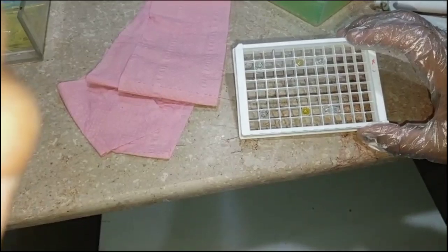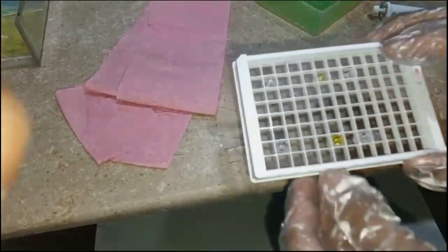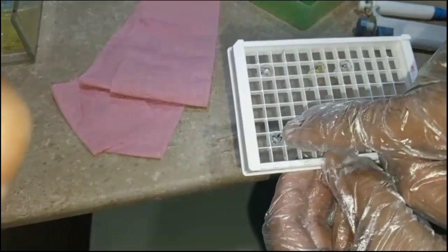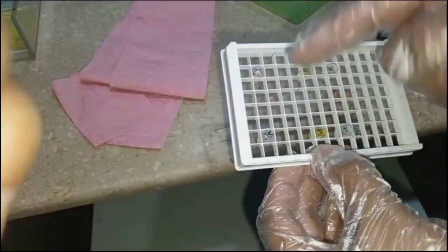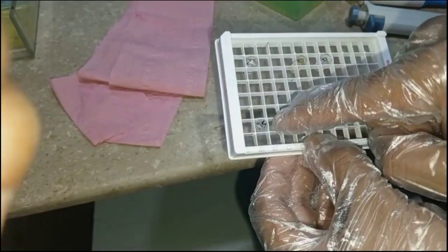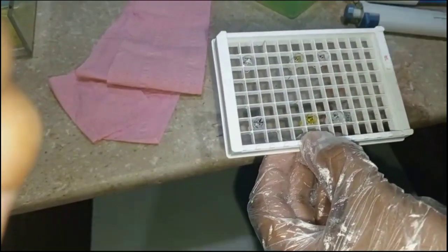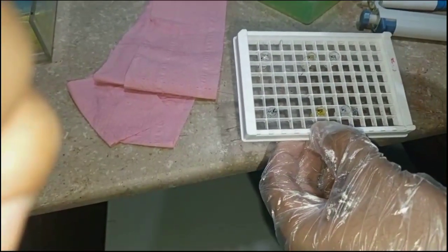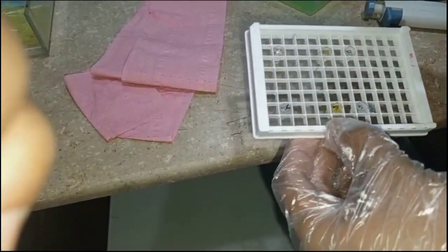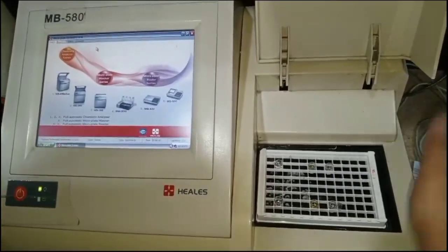As you can see, the second well of Ag and Ab is the yellow color. In case of the Ab it is also yellow color, but in case of the Ag it is positive, and in case of the Ab it is negative. Okay, the yellow color is negative in case of the Ab, and it is positive in case of the Ag. Similarly, in case of the Ab, the negative is yellow color, and in case of the Ag, the negative is colorless. Okay, so don't be confused, it is actually opposite to each other.